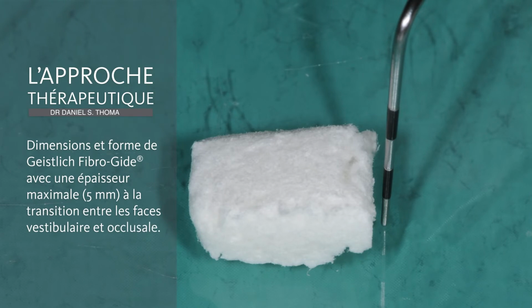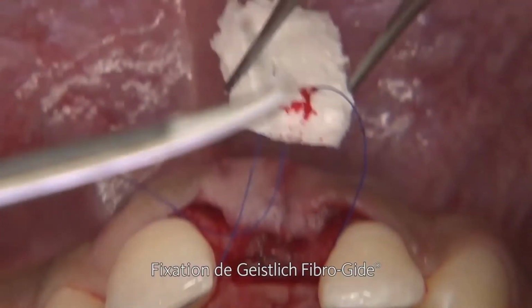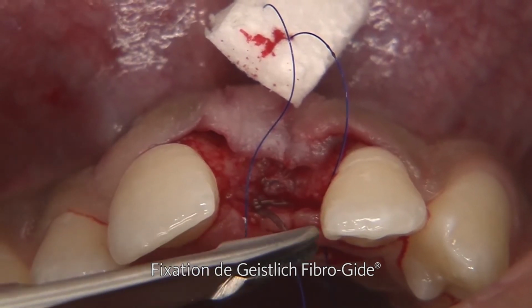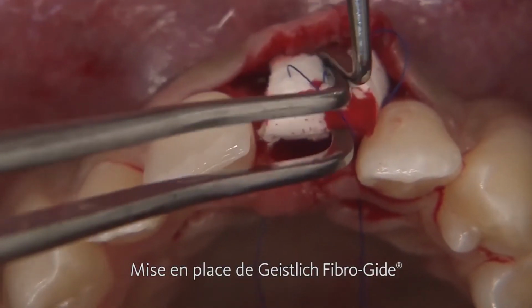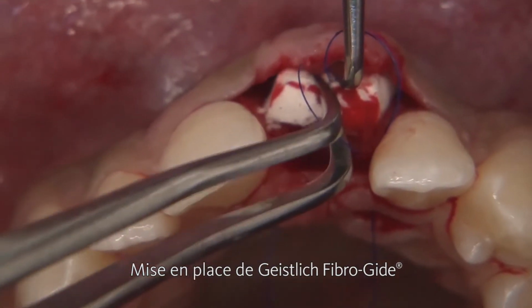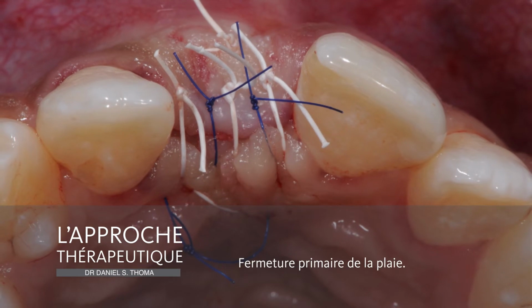Subsequently, the fibroguide is shaped to match the desired defect site, and thereafter the fibroguide is being sutured using horizontal mattress suture towards the palatal aspect. The entire matrix is subsequently placed on the buccal side, inserting it into the pouch. Following the placement, the initial suturing with a horizontal mattress suture towards the palatal aspect, primary wound closure is obtained.